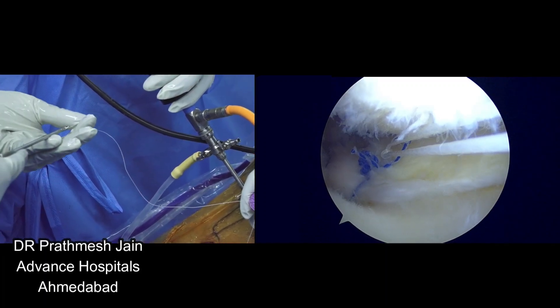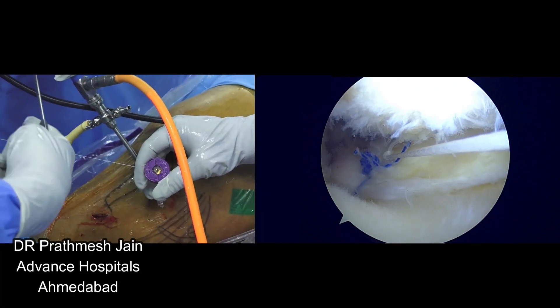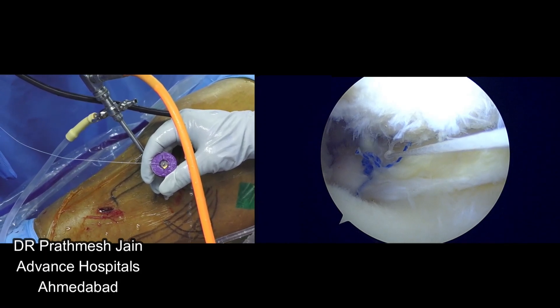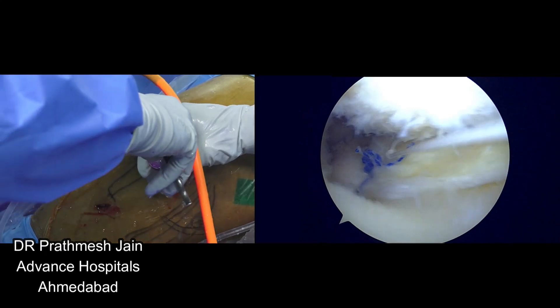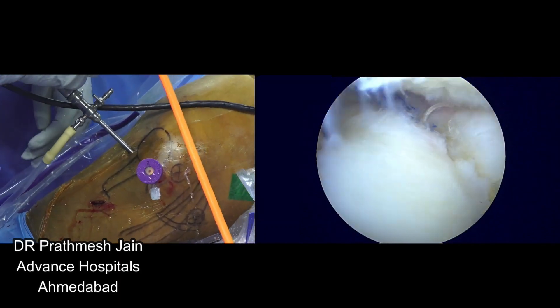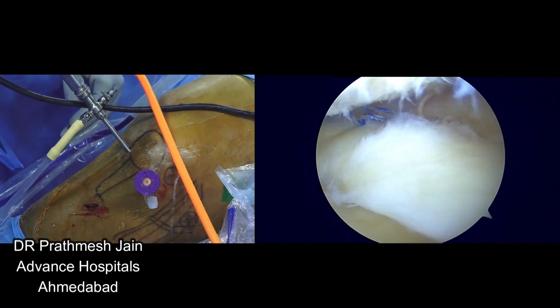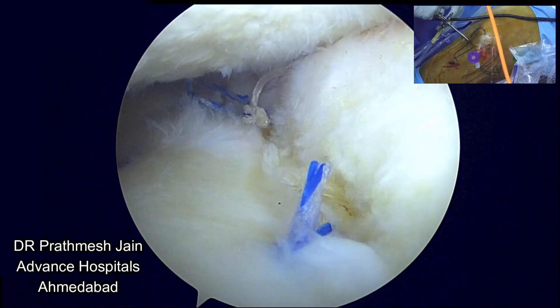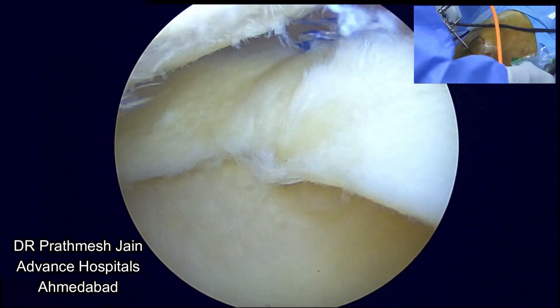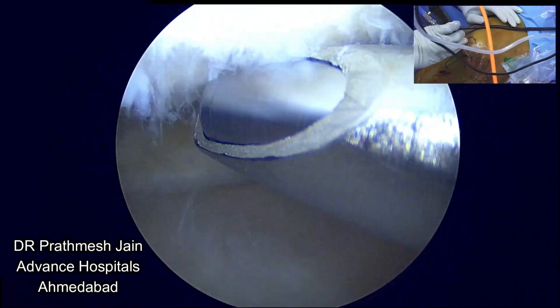So if you do it properly — meniscus centralization properly, extrusion repair anchors properly, and root repair properly — your meniscus is intended to come to functional position and the chances of osteoarthritis will surely be delayed. This is the root fix anchor we have used, along with one OsteoneX anchor for the body and one OsteoneX anchor for the anterior part of the meniscus. You can combine it with condoplasty procedures — if the lesion is big you can do a mosaicplasty or an ACI.